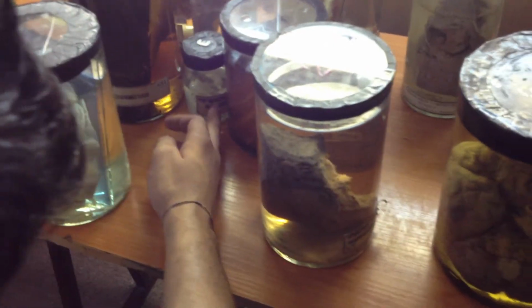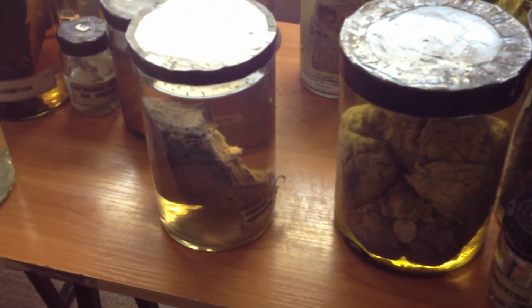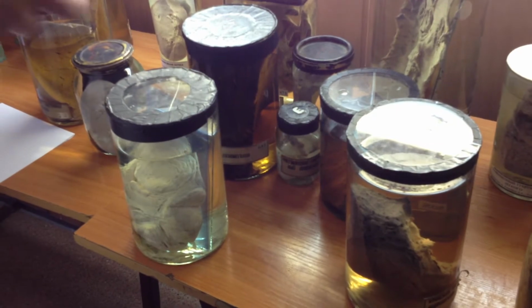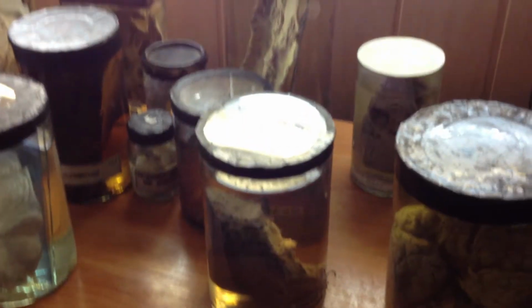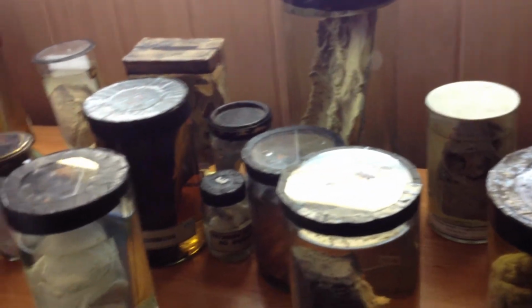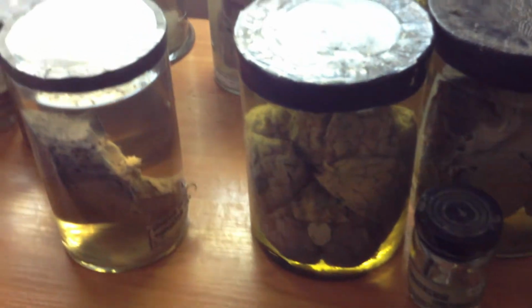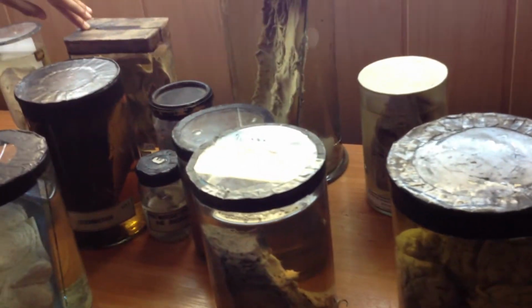The type of tumor may be established only on microscopic investigation. So if you have the description that this tumor had the signs of polymorphism, atypism, so that would be malignant, in most cases malignant types of liposarcoma. But only if you have clinical evidence that it relapsed, it may be evidence that the surgeon didn't remove it within the healthy tissue.